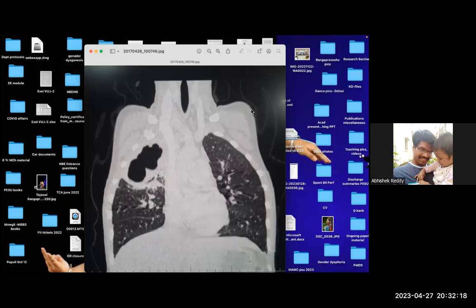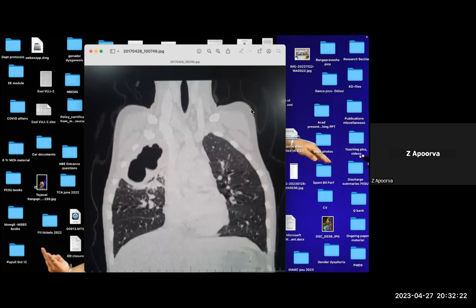Can be a CCAM or duplication cysts. Okay. How did you come to that diagnosis? I would describe it more. This is thick walled. It looks like one big loculus. I cannot clearly see septa in between. And it occupies almost the entire upper lobe in this section.